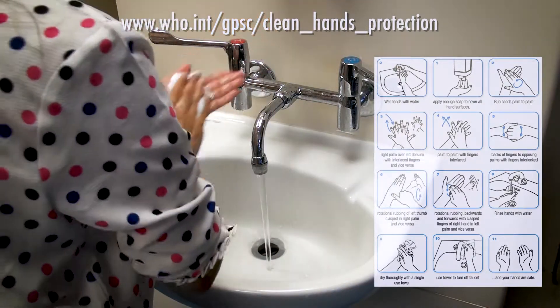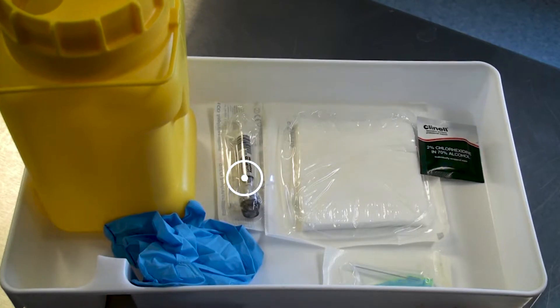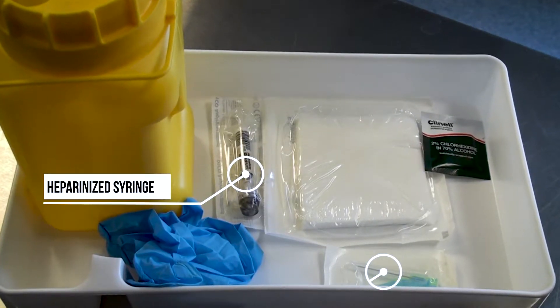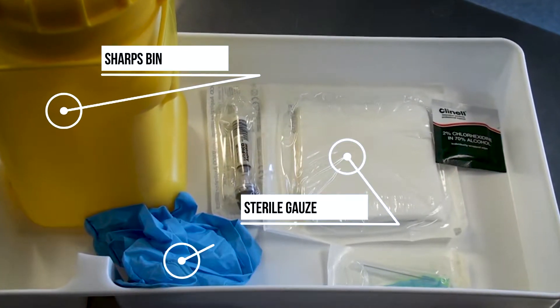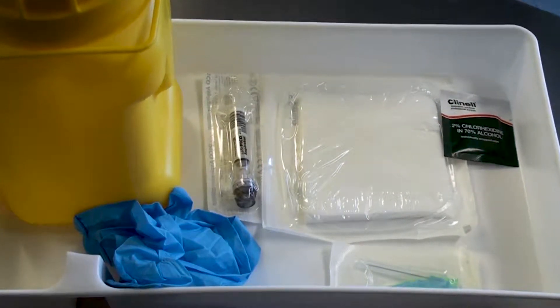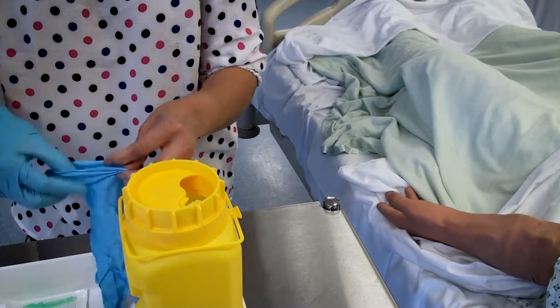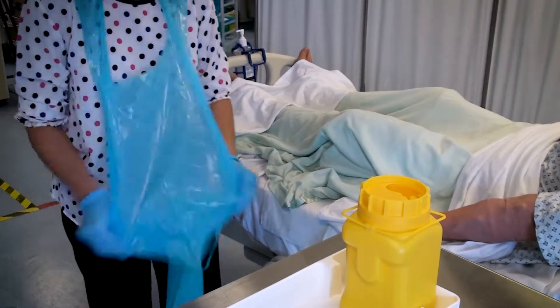Once your hands are thoroughly dried you may start to prepare the equipment. You will require a heparinized syringe, a blue needle, a sharps bin, sterile gauze, non-sterile gloves, and a skin preparation wipe which must be 2% chlorhexidine. You must ensure that you wear the appropriate personal protective equipment — in this case non-sterile gloves and an apron.